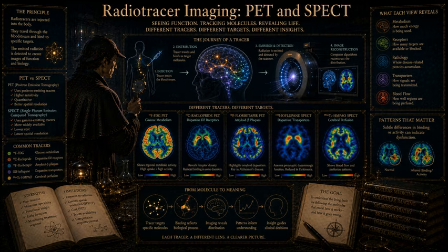Because of its staggering potency, even at strict tracer doses, 11C-carfentanil can occasionally cause transient side effects in research subjects, things like mild sedation, feelings of heaviness, or very slight hypoventilation. But these cases are the extreme exception. By and large, pharmacologic toxicity is simply not the primary concern. Meticulous radiation dosimetry is.